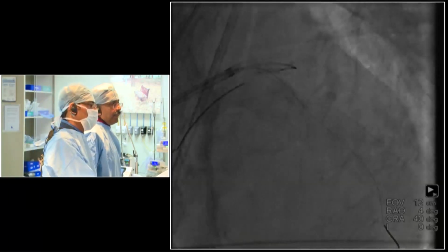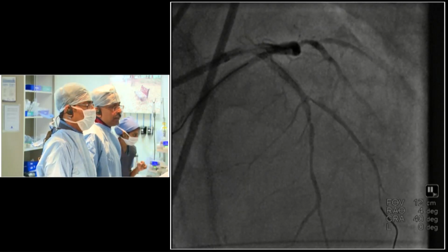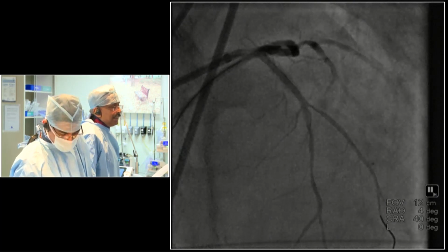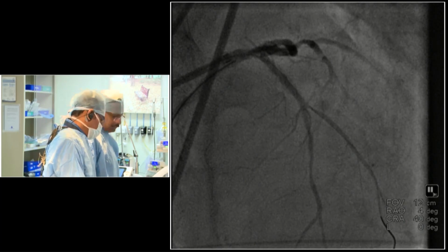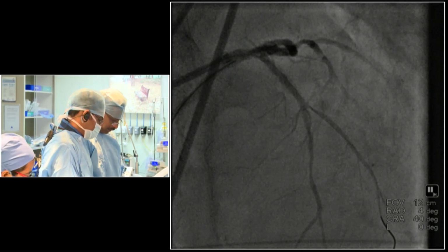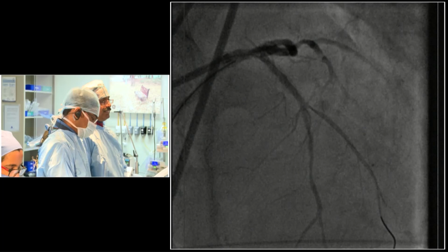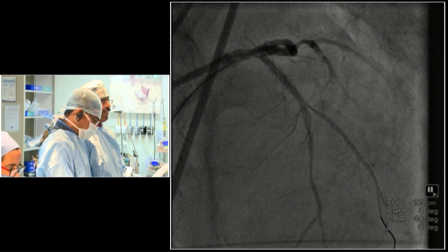Because already we have a complicated LAD, proximal left main. Then, Vijay may have shown you that the part of that LAD which is diseased after the diagonal is intramyocardial. The normal segment seems to be just above that septum. So the stent will have to be placed intramyocardial.